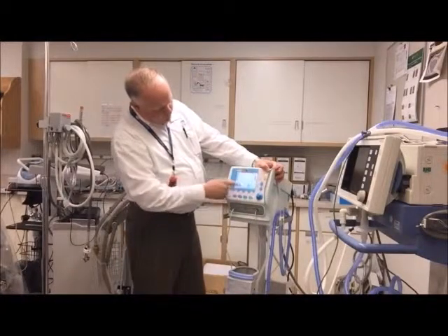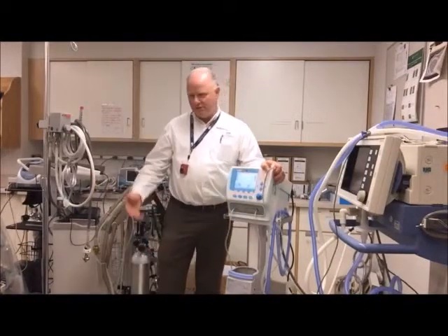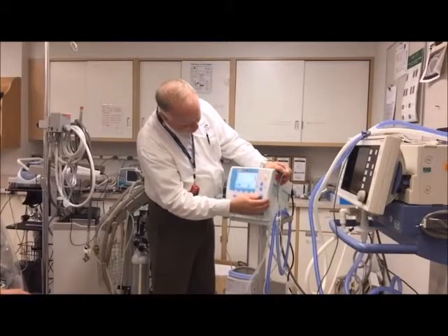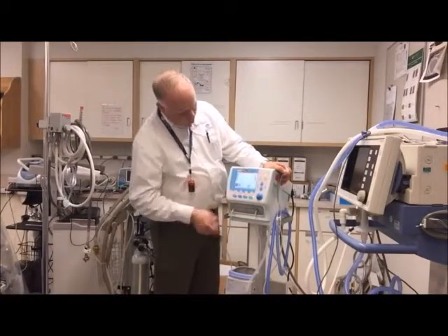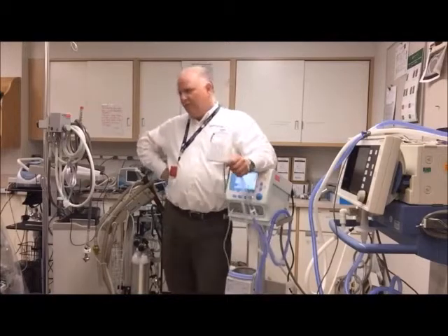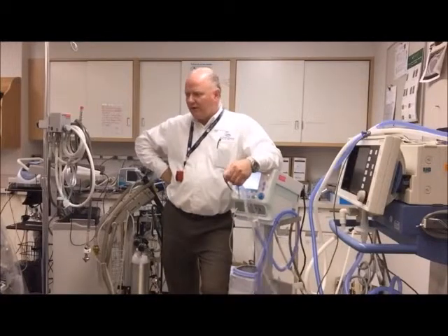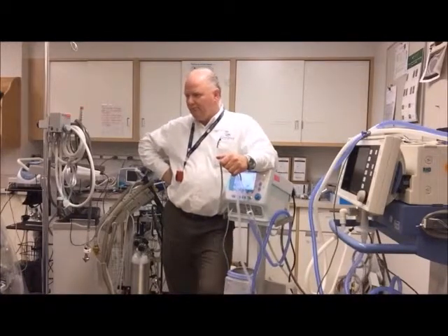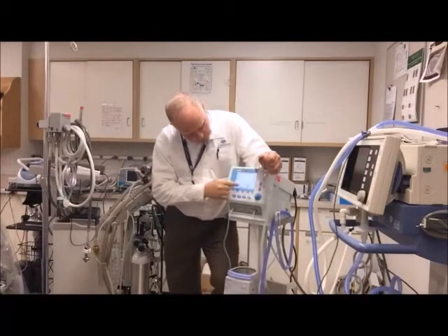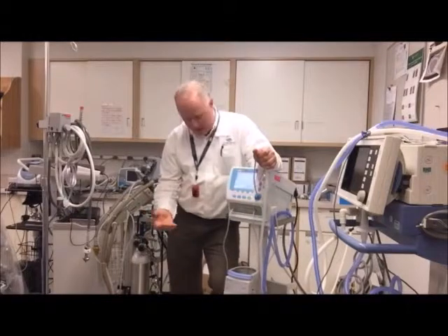Now in standby, we can make any settings we want. For CPAP, a common setting might be six, six and a half, let's do seven centimeters. For a recruitment breath, you could set a higher pressure — say 10 or 12 centimeters; 15 is the maximum. Let's put it at 12 so that if you want to give a bigger manual breath, that's configured.